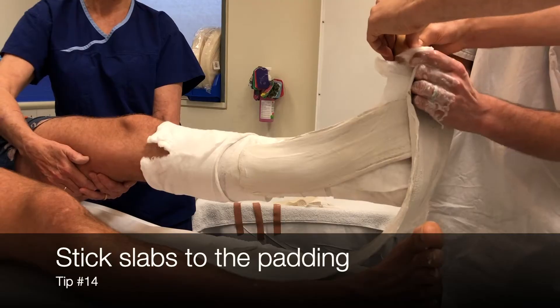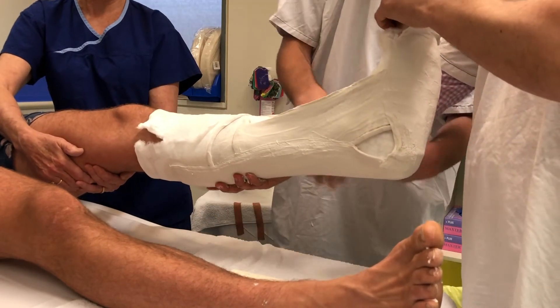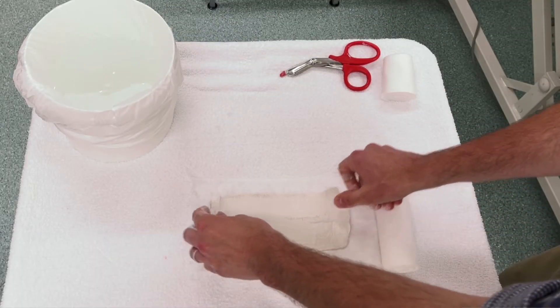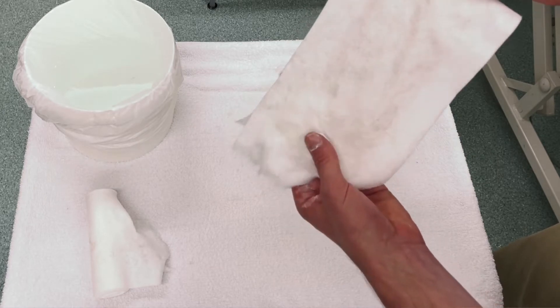Make sure the plaster never goes beyond the padding, or it will contact skin and be rough. For backslabs, a common problem is that they fall off, especially at the ankle. With wet hands and wet plaster, you can press the plaster onto the padding to make it stick, then bandage it in place — eliminating the need for an extra person. Alternatively, place the slab on the sole of the foot first and start bandaging, adding it back against the patient as you go. Also, wrapping your plaster slab in a layer of Webril means the crepe won't stick to it, making removal much easier.